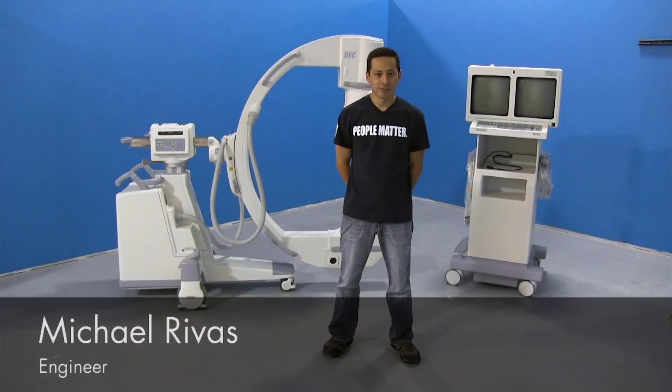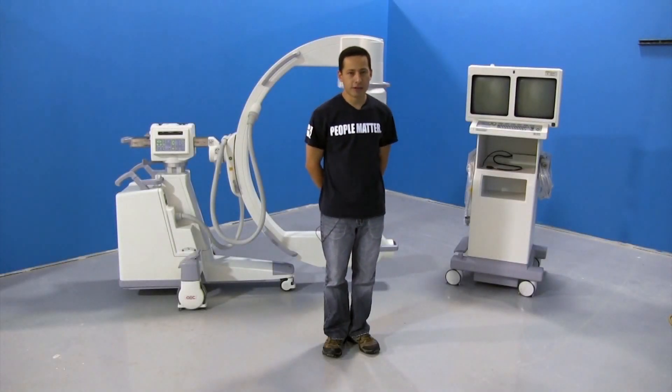Hi, I'm Mike from Block Imaging. Today I'm going to help you go through an install for a 9800 OEC.